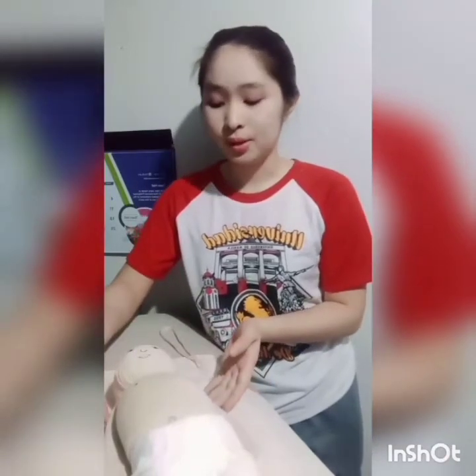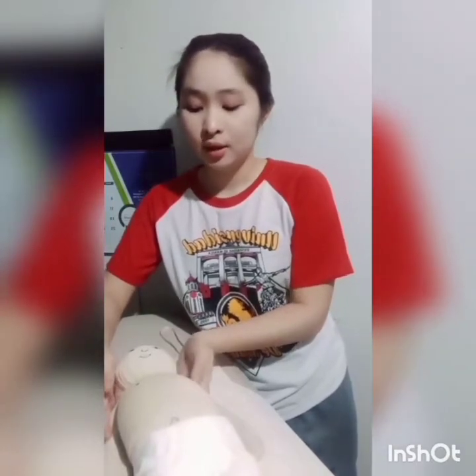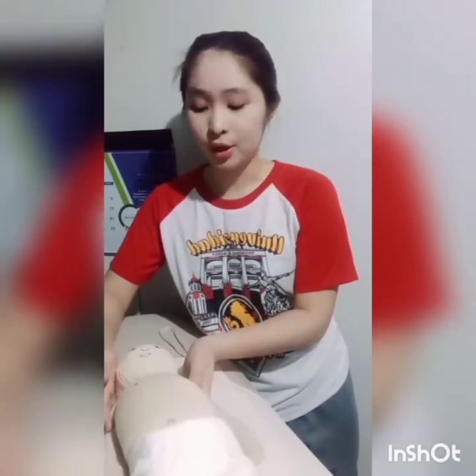So usually the assistant measurer is holding the baby's head at the back a little bit, with palms cupping both of the baby's ears, and making sure that the posture of the baby is straight and her head and her back is not curving.